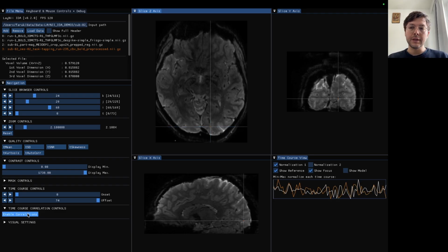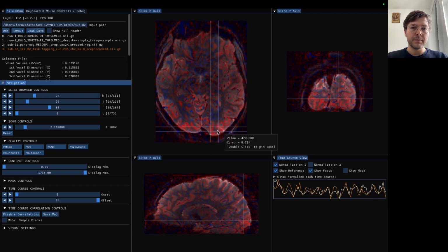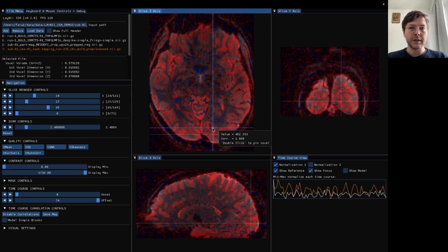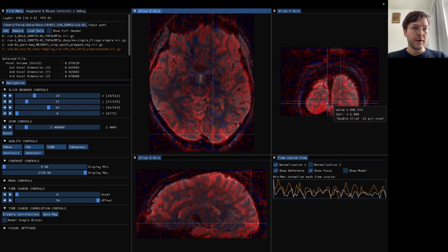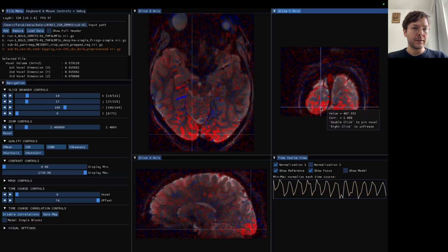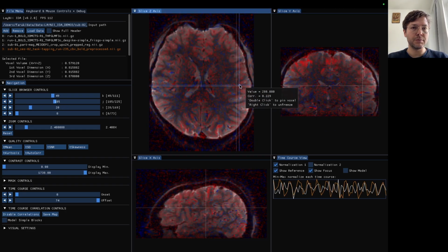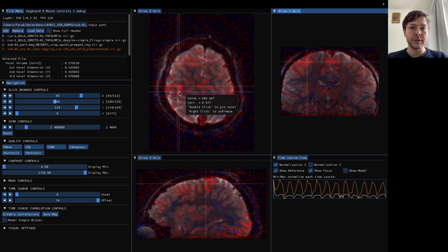And of course, we can now enable one of the coolest features of LayNii IDA, that is the real-time correlations. And then we can immediately highlight those periodic patterns that we can pick up from the 30-second on and off checkerboard watching task. Checkerboard watching and finger tapping at the same time. So we should see some motor cortex activity as well, as you see here.